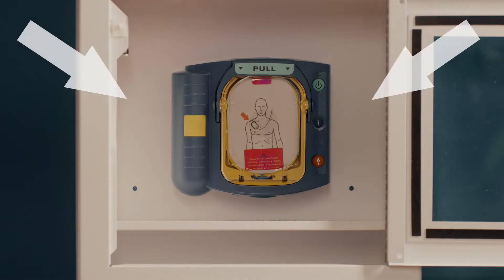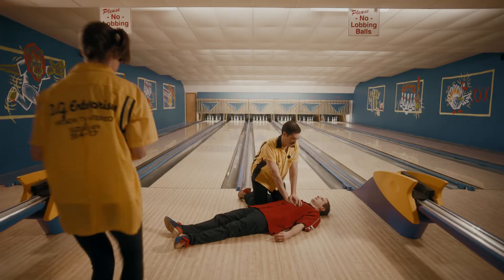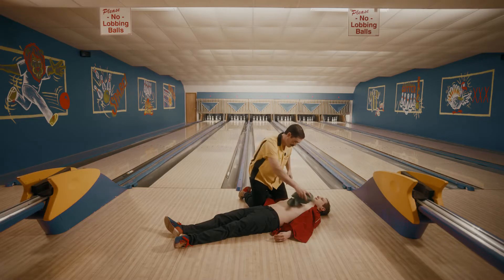In most cases, it's on a wall or a clearly marked area. Put the AED on the floor next to the victim's head closest to you. Undo or remove the clothing from the chest. If the chest is wet, dry it off.